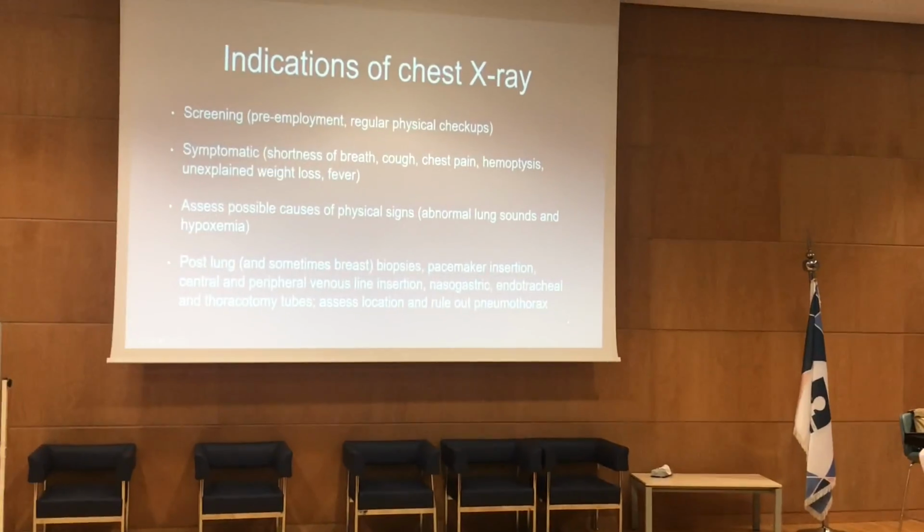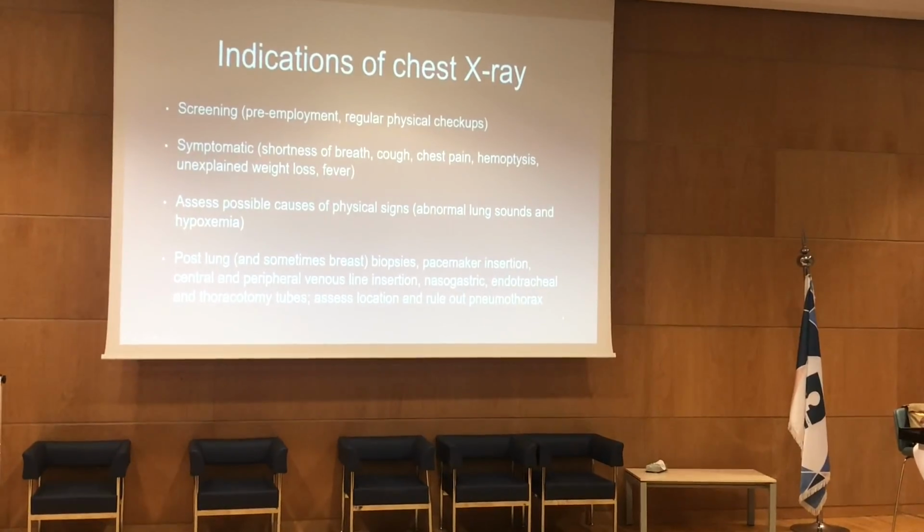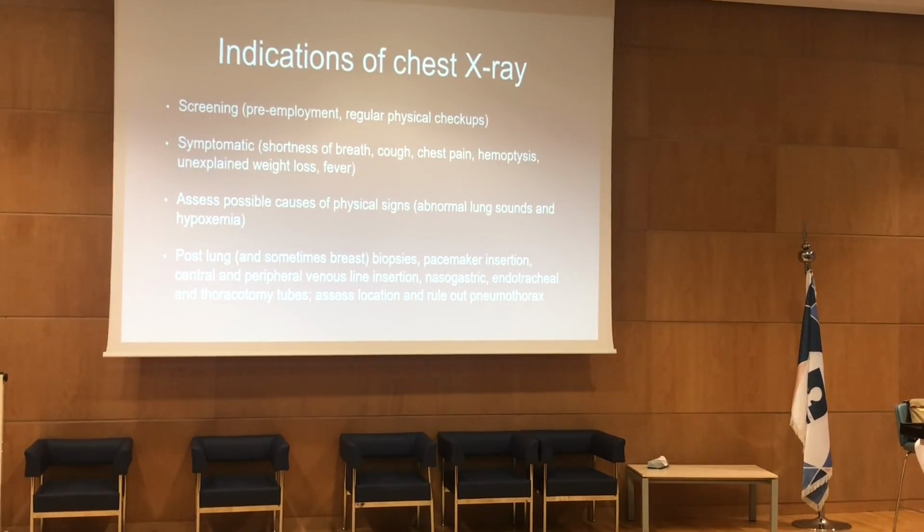One of the most frequently requested radiological exams, especially in the emergency setting. And the reason for that is that it covers the cardiopulmonary system. It's cheap, it's easy, it doesn't require any patient preparation, and it's also of low dose. So it gives you a quick idea of what the patient might be suffering from.